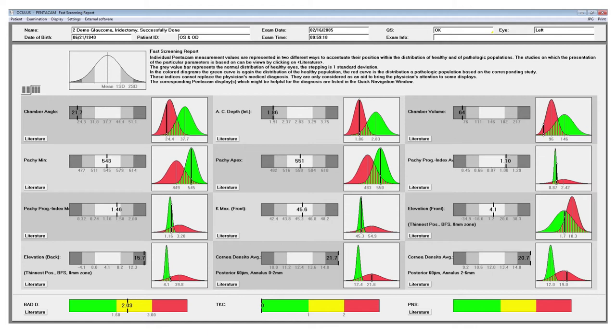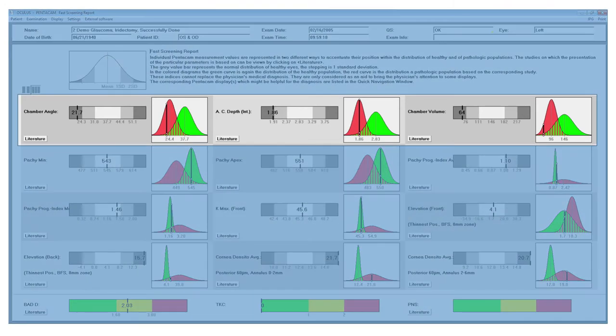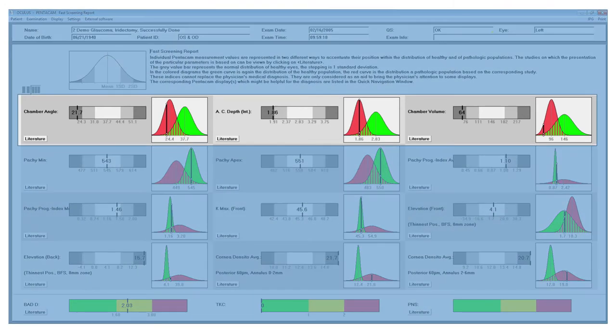This can be helpful for quickly assessing to see if there are any abnormalities that could potentially be pathological. This is good for detecting occludable angles, detecting early ectasia, and detecting corneal opacity such as corneal edema or scarring. This is an example of a patient with occludable angles and as you can see their chamber angle, chamber depth and chamber volume are clearly in the red.